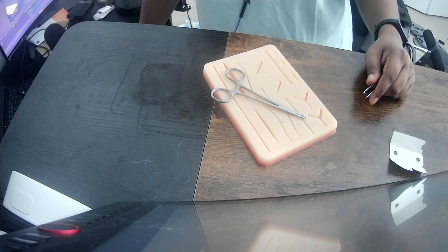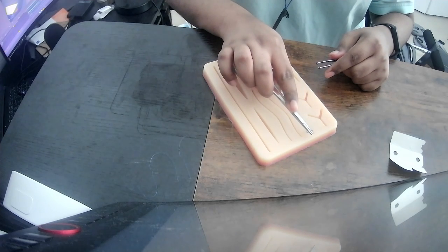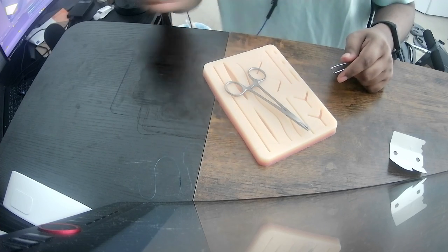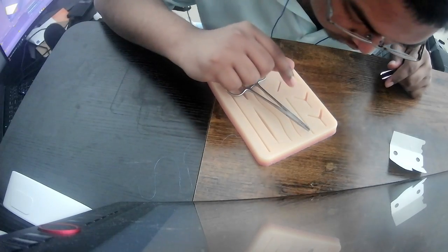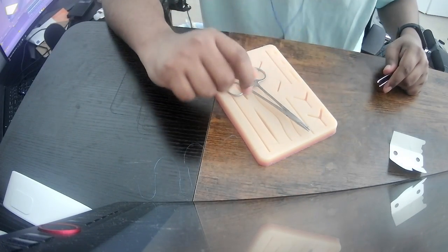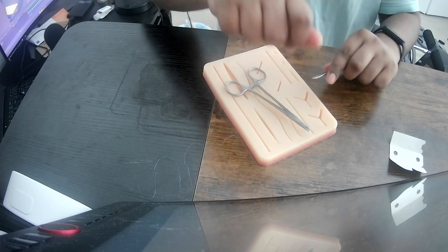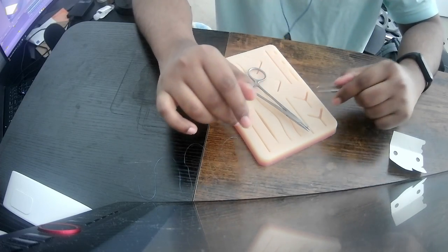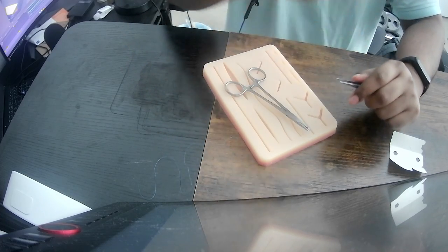And then, okay, so the video I'm watching, they seem to be driving the needle very close to the wound and opening up very close to the wound again on the other end. Okay. Just drive it through and make sure that you're using your wrist to push, but more your wrist to rotate. And the depth, I don't know if the depth is okay, but I definitely need to get the hang of driving adequately. There's like a finesse to it. You gotta drive it with enough force and also maintain this kind of arc through the wound.